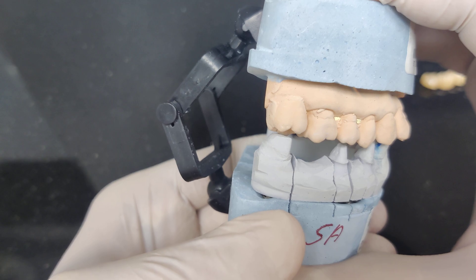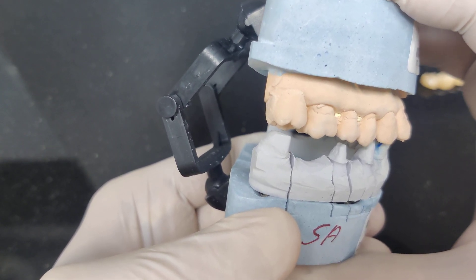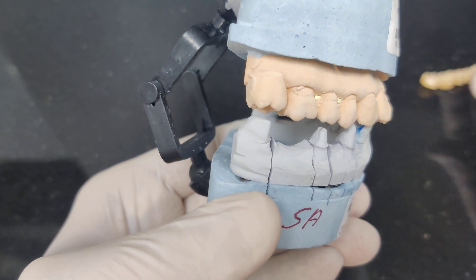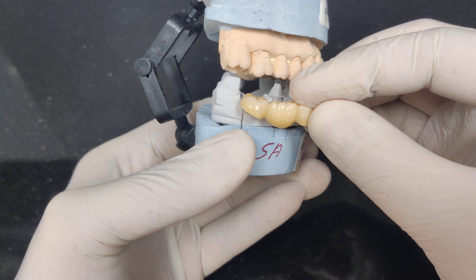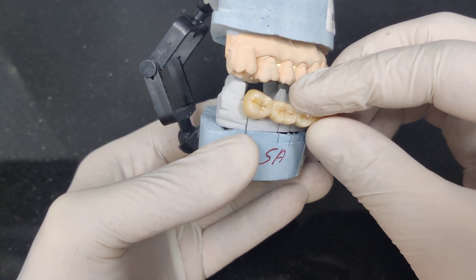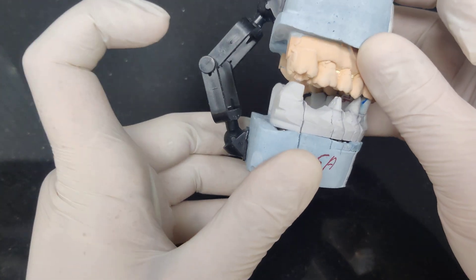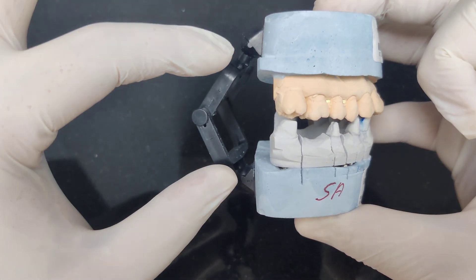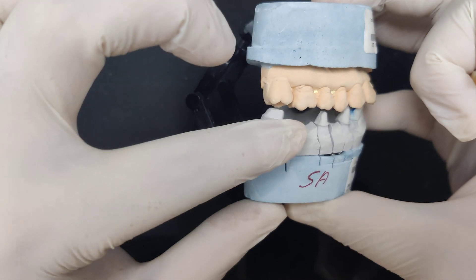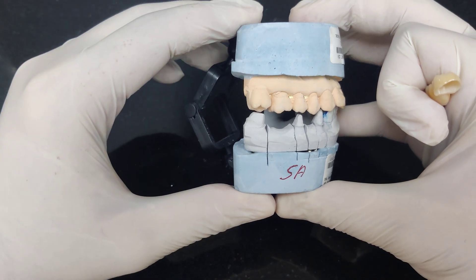But this may look to the technician as if there is less than desired vertical, which means I may have to keep grinding this in the patient's mouth unnecessarily — which could very well have been avoided if my technician used the right articulator and did not use a hinge. So remember: please speak with your laboratory technicians — do not use these plastic hinge articulators, especially when you are working on distal extension cases.